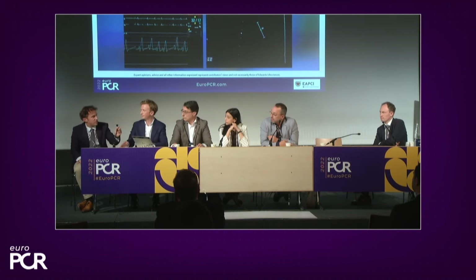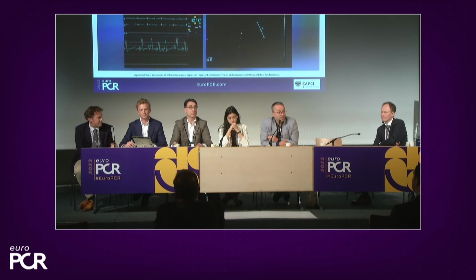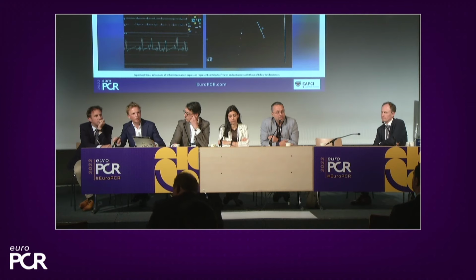Indeed, probably the worst complication is not being able to improve the result. So sometimes the message that you have to give is that the worst thing that can happen is that you leave the cath lab with the same result that you got in at the beginning. One of the really nice things about these procedures is that procedural complexity does not correlate to patient risk. If you have a difficult TAVI, for example, that's usually high risk for the patient, but a difficult mitral or tricuspid procedure is not high risk for the patient, it's just more difficult for the operator.